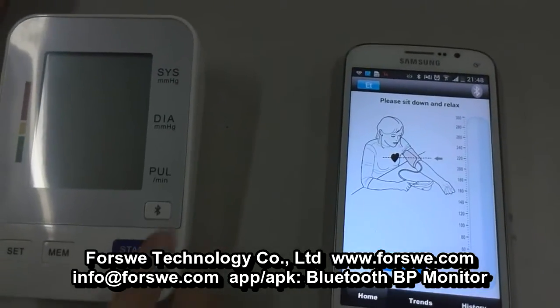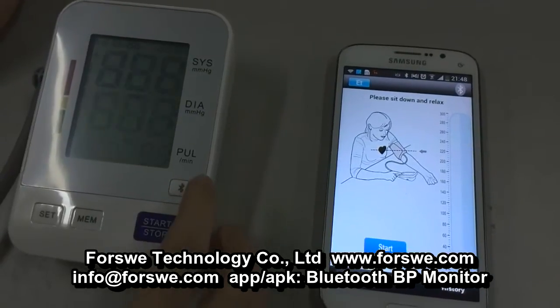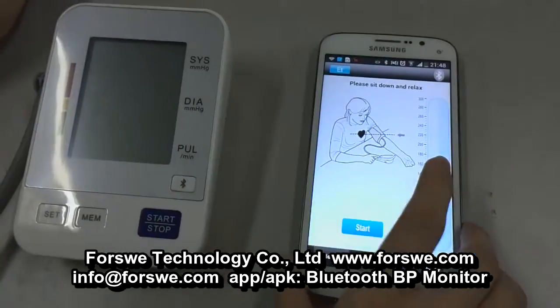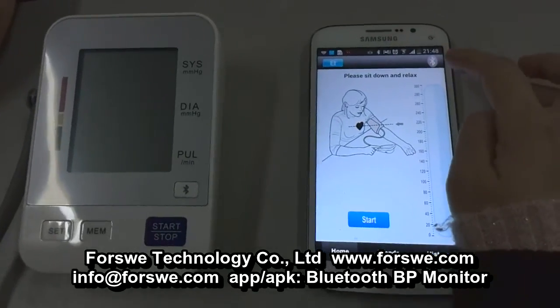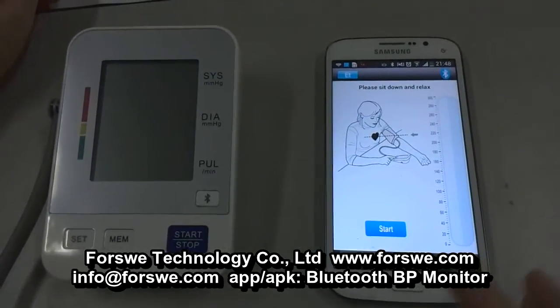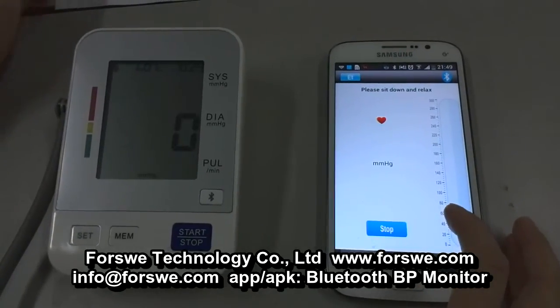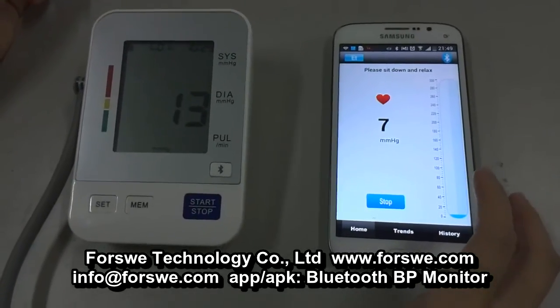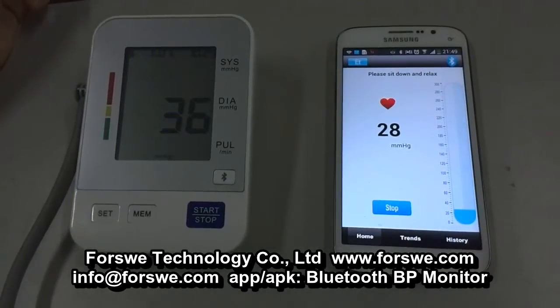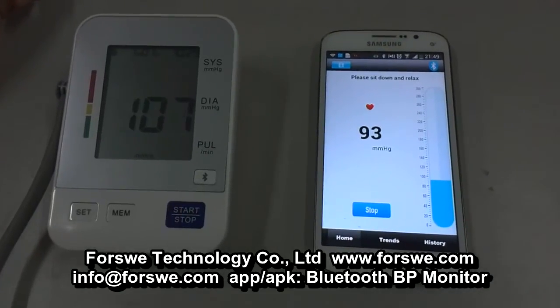Then connect the device to Bluetooth. You have to make sure the Bluetooth logo is lit before measurement. Then press the button 'Start'. Now it starts. Make sure you stay quiet and relaxed during the progress.